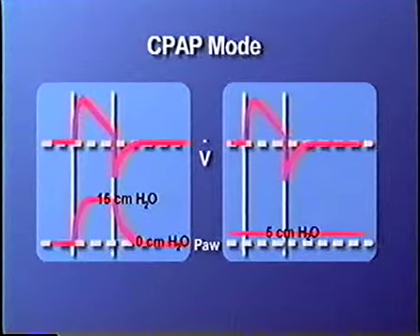In the CPAP mode, there is no set breath rate. When a patient trigger is detected, either a spontaneous breath or a pressure support breath is given, depending on the pressure support setting. The graphic on the left shows the CPAP mode with pressure support set to 15. The graphic on the right shows the CPAP mode with pressure support set to 0, PEEP set to 5.